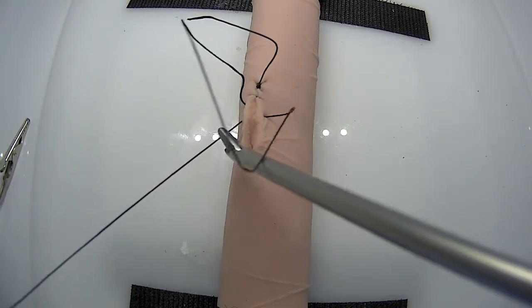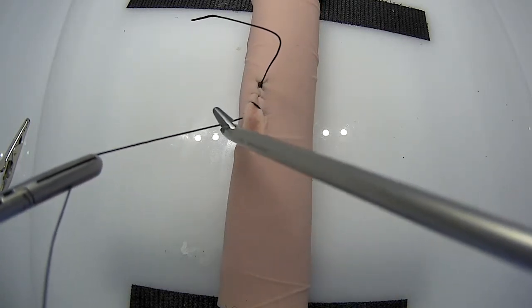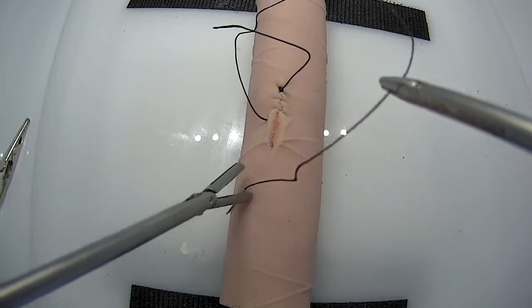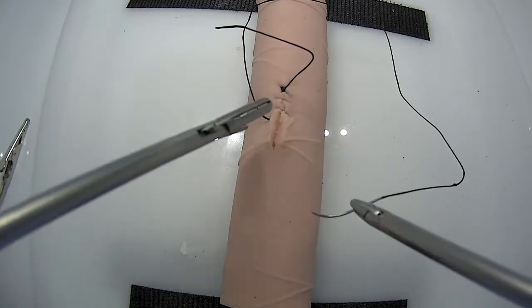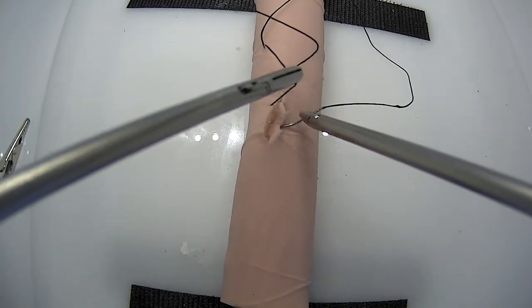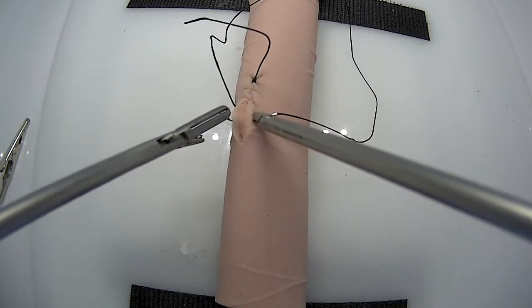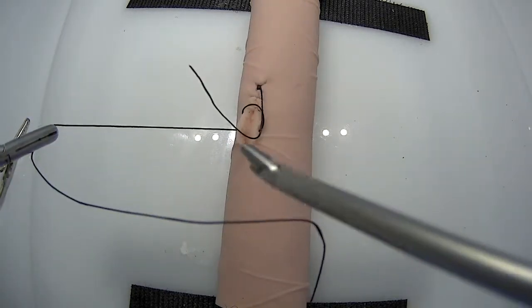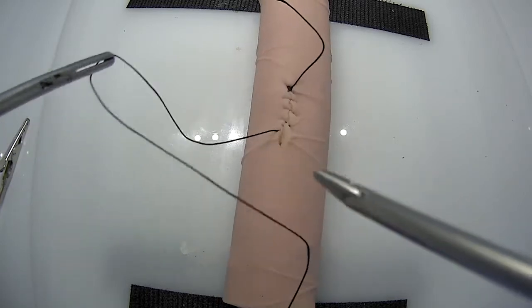Make sure not to lock your suture as you go and to lower your loop down where you want it in a precise fashion. This is a really good task for practicing needle loading and precise suture placement. Cinch to make sure it's tight, and keep going.